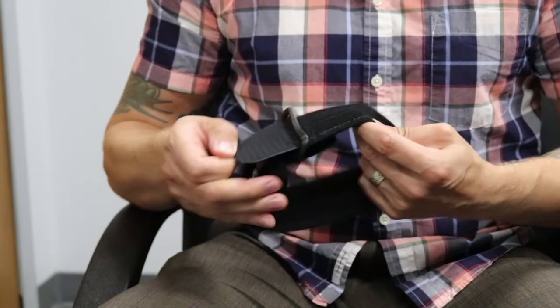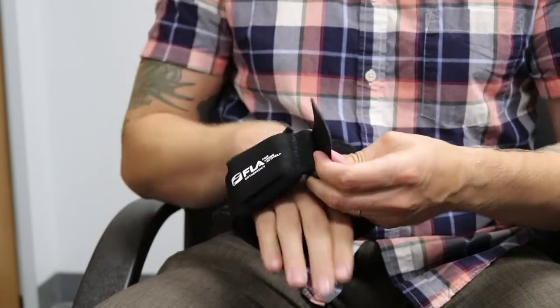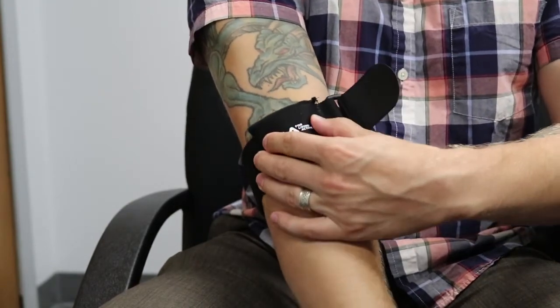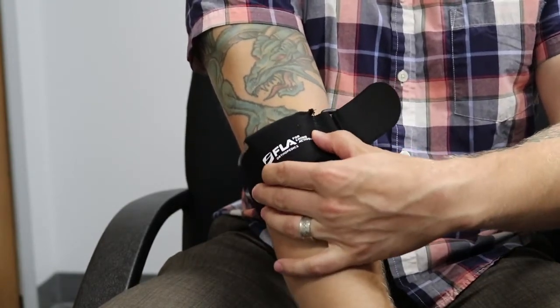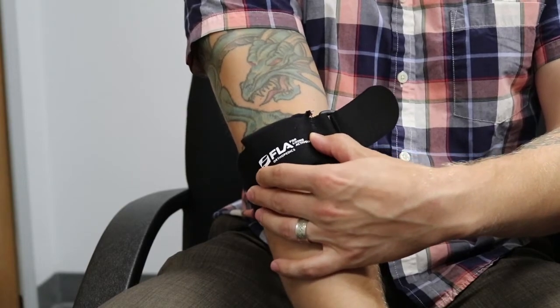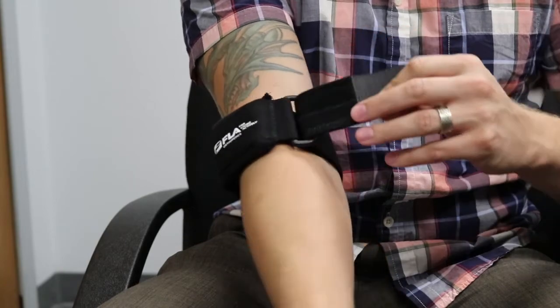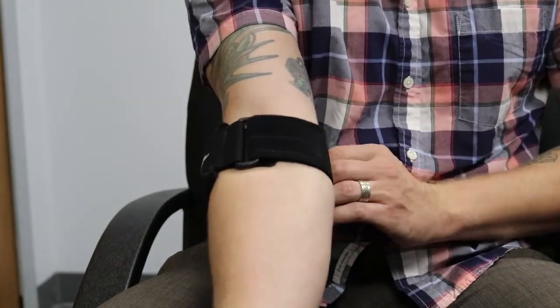To apply the armband, you will need to loosen the strap, slip the band on the arm, and position it with the gel side centered above or below the forearm, depending on where the compression is needed. Once you have it in place, you simply adjust the strap snugly.